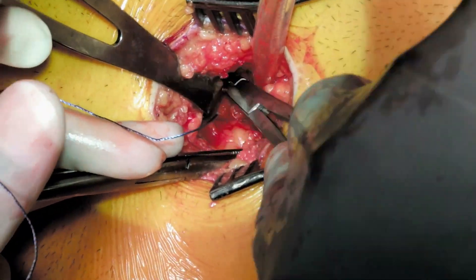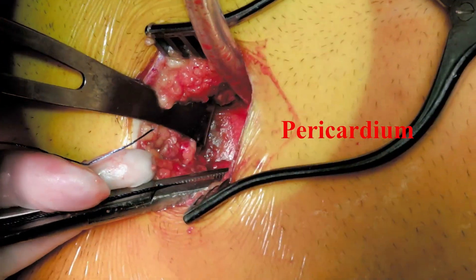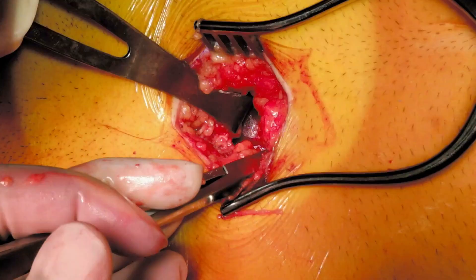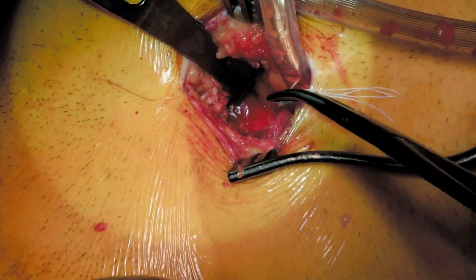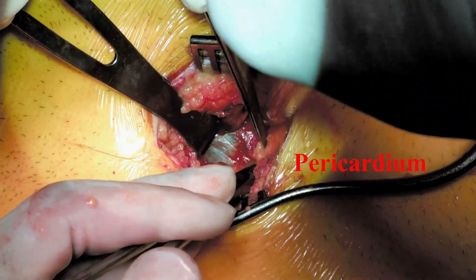Now that I've got the xiphoid process removed, you're going to be able to see the pericardium. I'm using an instrument to take away the fat and some flimsy tissue on top of the pericardium. It's very important that I grab the pericardium and not injure the heart below it. I want to clearly see the pericardium — that blue color you saw briefly — so I'm getting another instrument to clear off blood and tissue on top of it.